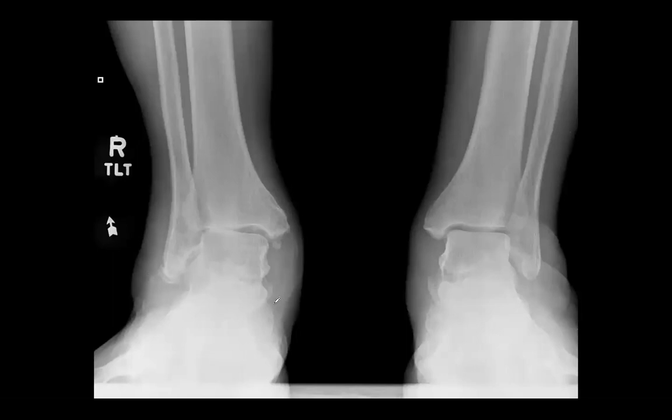Anybody want to read this one and tell me what stage flat-foot it is? I can go ahead and try. Looks like the ankle is in slight valgus. There's some slight arthritic changes in the ankle joint, which would make me think this is probably a later stage, possibly 3 or 4.